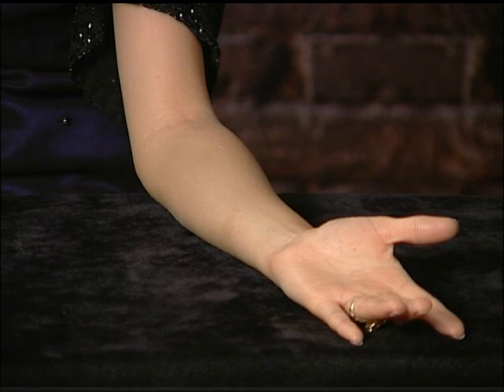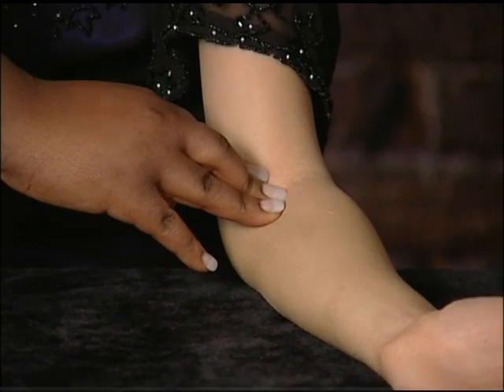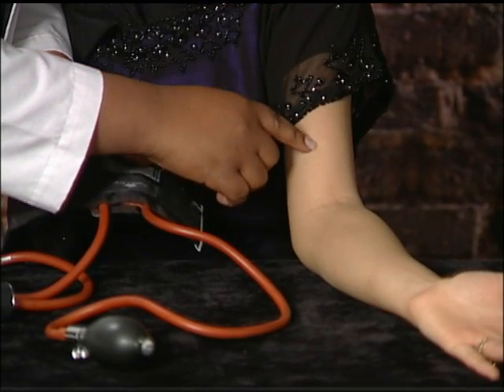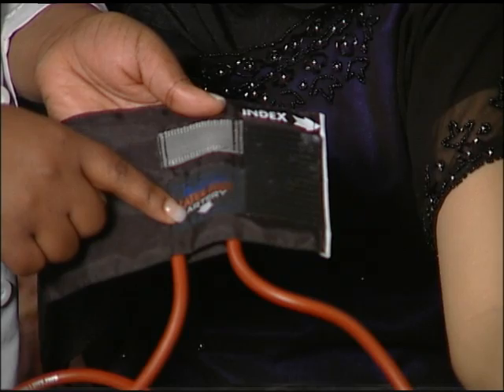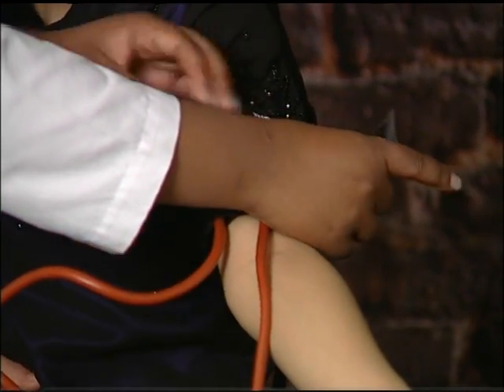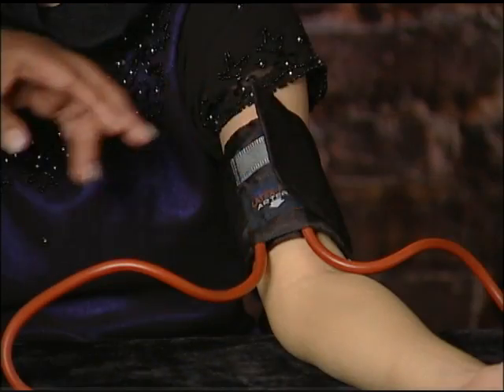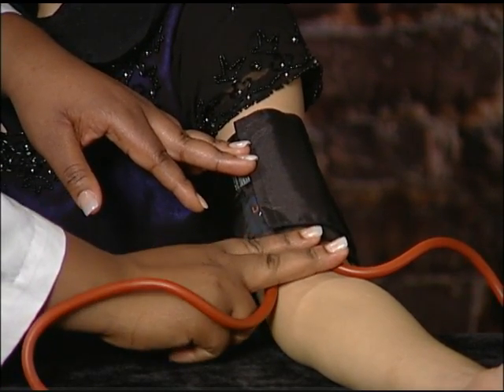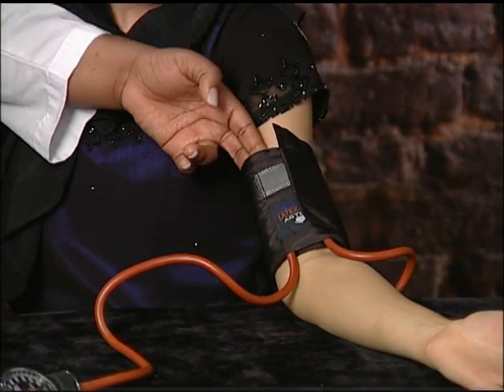To measure the blood pressure, first use your fingertips to feel for a pulse of a major blood vessel located on the inside of the arm at the level of the arm crease. The artery mark on your blood pressure cuff should be placed around this area. Wrap the blood pressure cuff around the patient's arm, making sure the artery mark is placed over the major blood vessel. The cuff should be placed on the upper arm with the bottom edge about one to two fingers above the arm crease, and tight enough to allow just two fingers to fit under it.